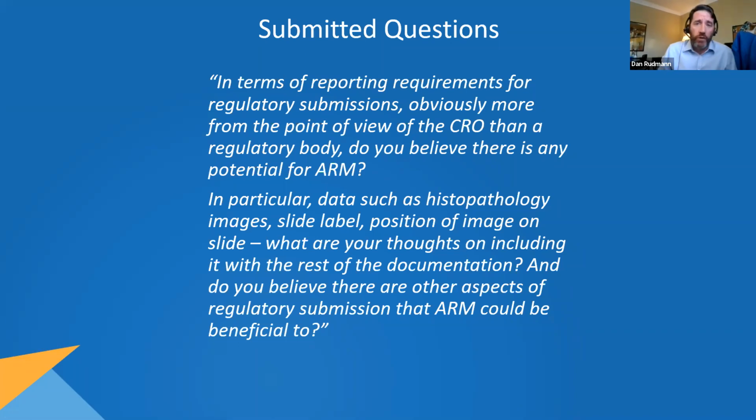So that would have to undergo, if it's part of a GLP study, good laboratory practice study, it would have to undergo validation. But you know what? I'll be honest with you. We've been validating machine learning for decades. I've been at several companies where we've developed machine learning algorithms that we've used as part of submissions to regulatory agencies. There's well-defined computer validation methodologies by the regulatory agencies. There's a lot of people out there that know how to validate systems. So it's really not a barrier. It's just a matter of, do we need to validate it or not? That's the decision. There's no reason to validate if you don't need to.